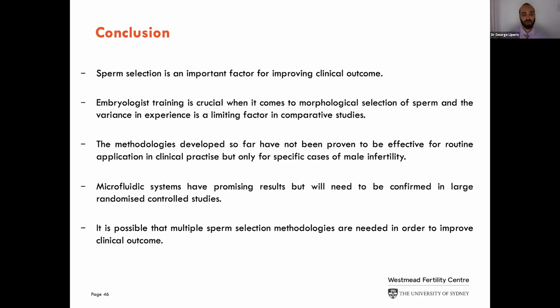The new microfluidic systems in place have promising results, but will need to be confirmed in large randomized controlled trials. And it is possible that in the future, there will be multiple sperm selection methodologies applied in order to improve clinical outcome.